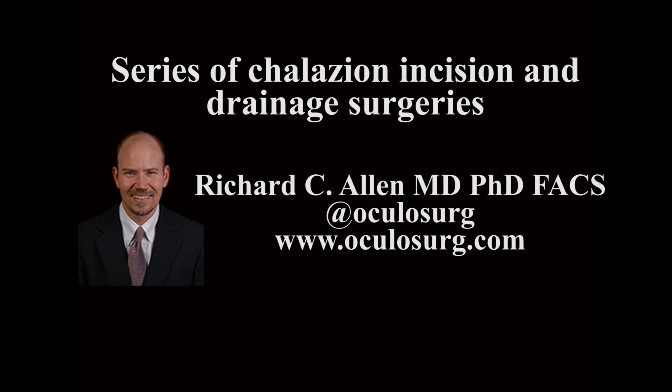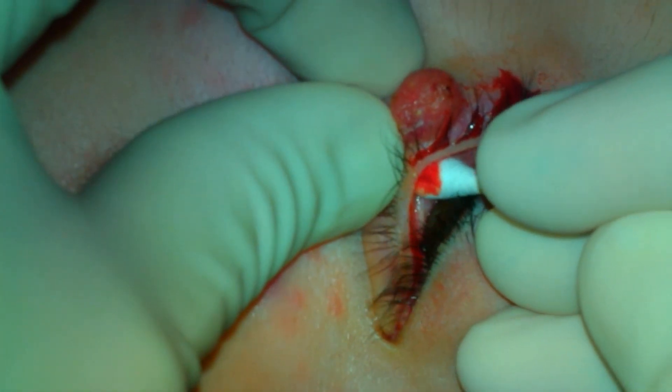This is Richard Allen at oculosurg.com. This video demonstrates a series of different chalazia that will be treated surgically.